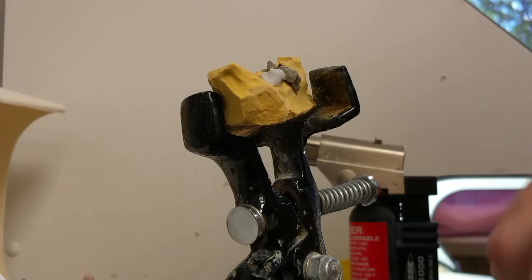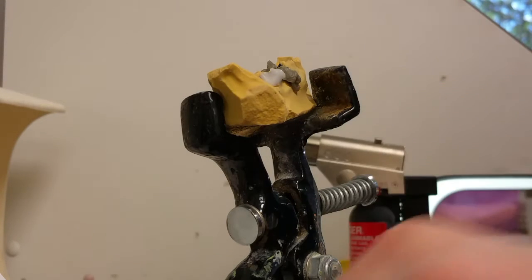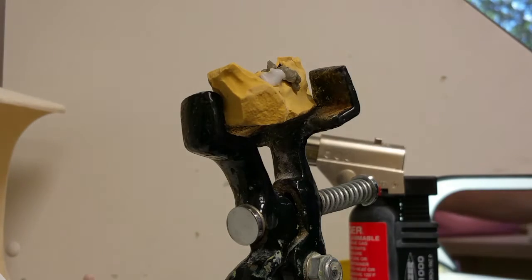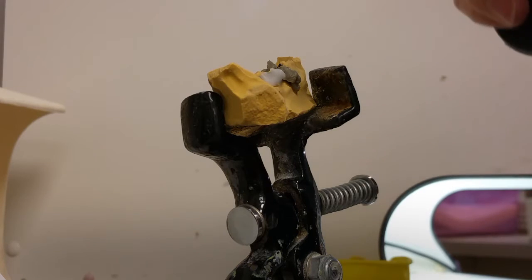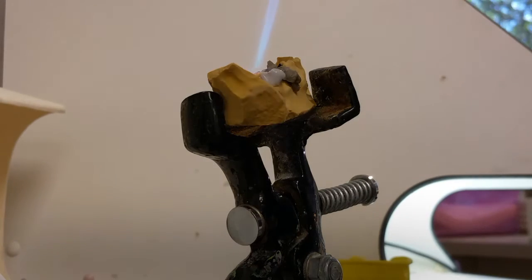As I get my solder ready, I put it on my hemostats and turn on my suction to keep the fumes away from my face. I'm using a micro torch called a blazer for this operation.